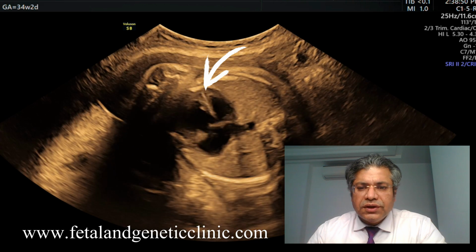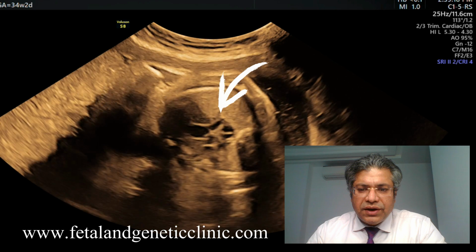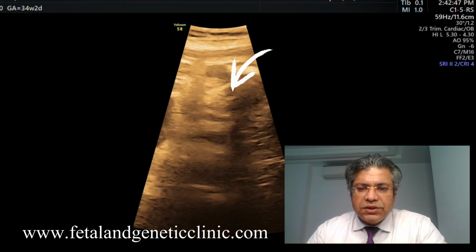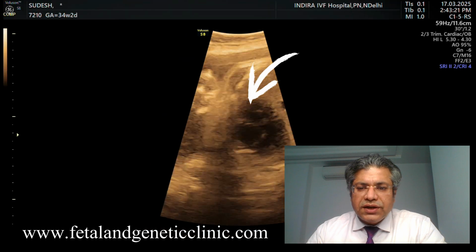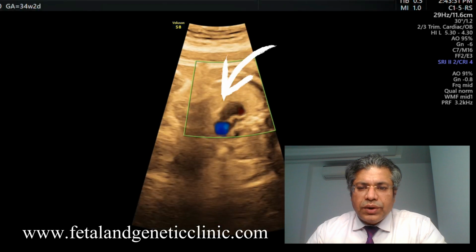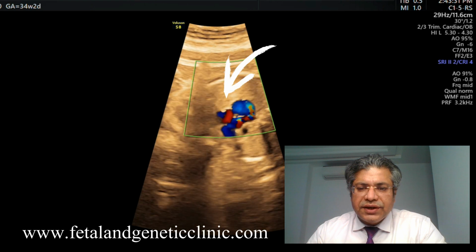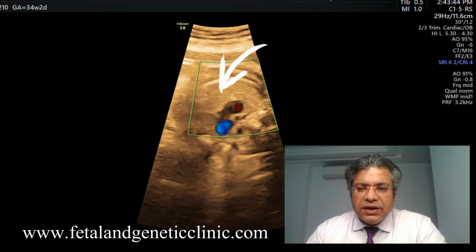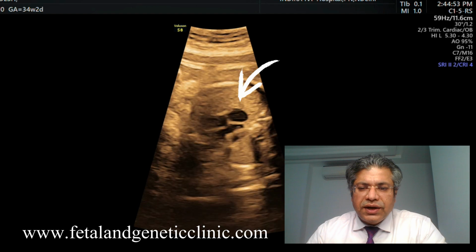So that was expected. Now this is a finding that was not expected. This is the right ventricular strain. We identified that the right ventricle is hugely dilated. Then we look at the pulmonary artery, and you see that there is pulmonary artery stenosis. The main pulmonary artery is getting stenosed, and we are having a post-stenotic dilatation. When we put the color, we identified the aliasing in the main pulmonary trunk, which suggests that it is very high flow, and this is the post-stenotic dilatation.